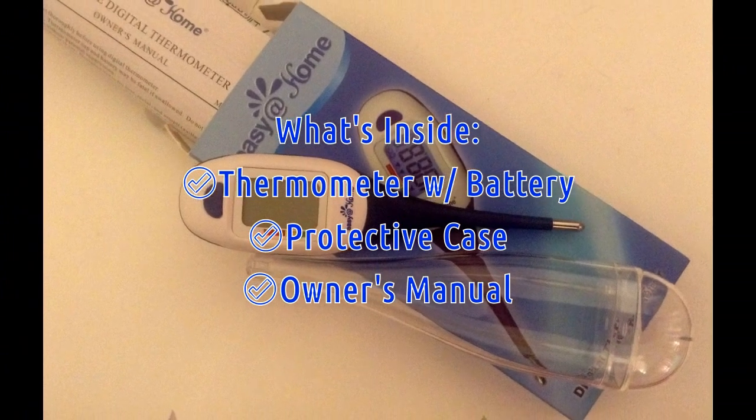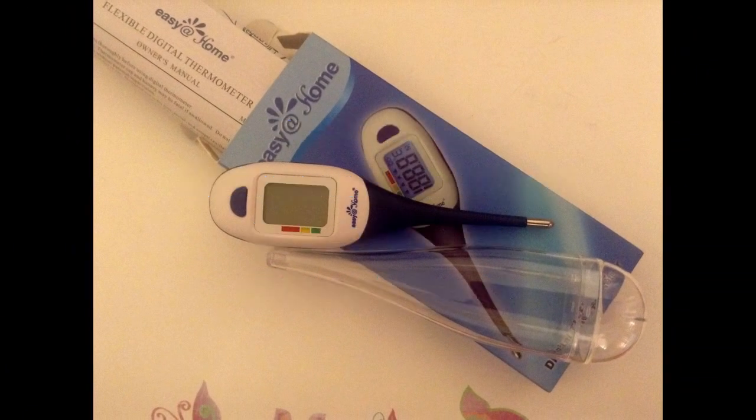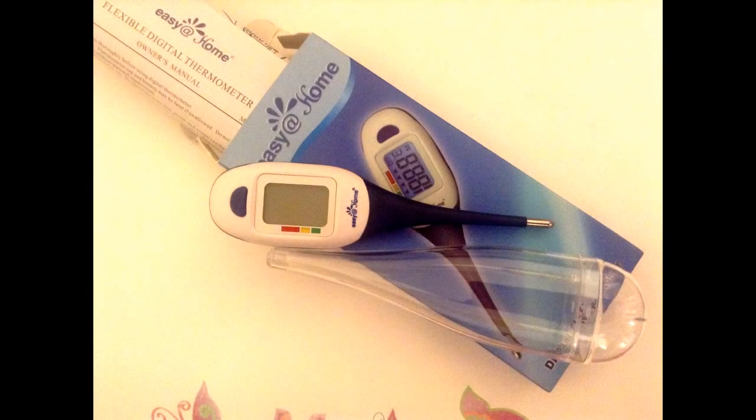The thermometer itself comes in a clear protective case along with a very user-friendly owner's manual, all inside a flat box. I recommend to keep all original packaging and especially the useful owner's manual for later reference.